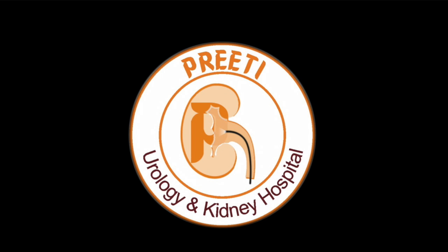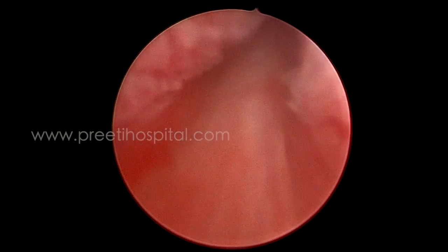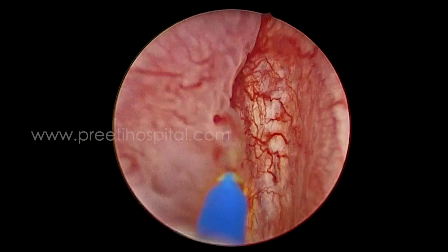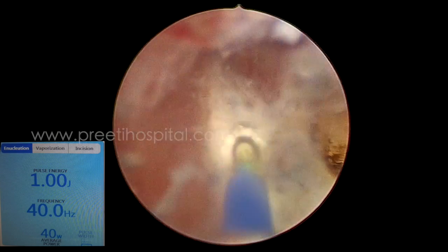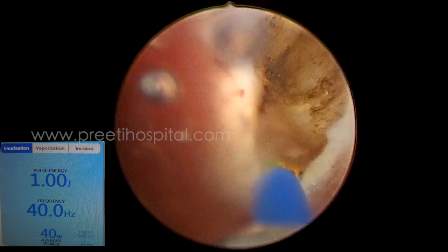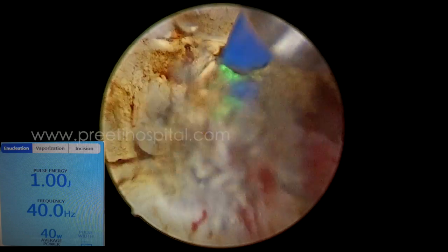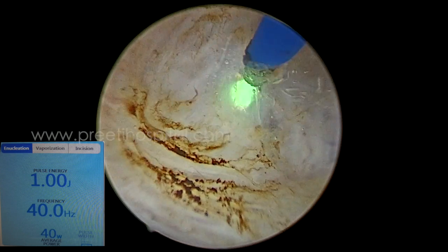This is a case of thulium fiber laser enucleation of the prostate during which a left ureteric orifice injury occurred. The surgery focuses predominantly on the enucleation at the bladder neck region. This is a 1J 40Hz enucleation, like any other enucleation. An inverted lambda incision at the veru level is given on either side of the grooves, after which the incision is extended anteriorly. This is the capsule at the 12 o'clock position.